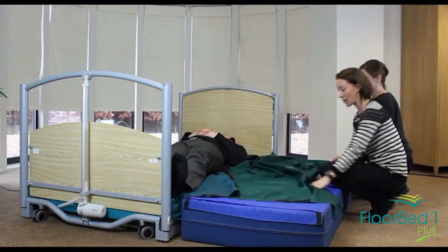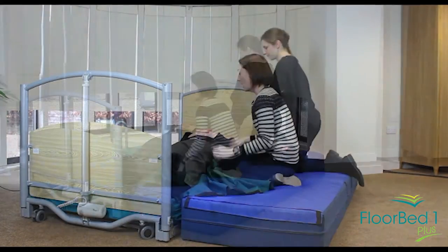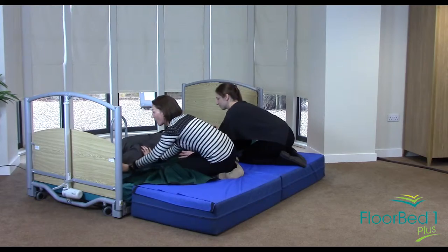In order to make sure he's really safe, what we will then do is come onto the safety mat and just slide him a little bit further onto the bed.